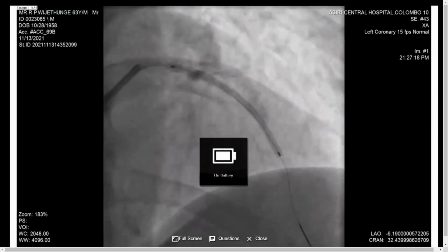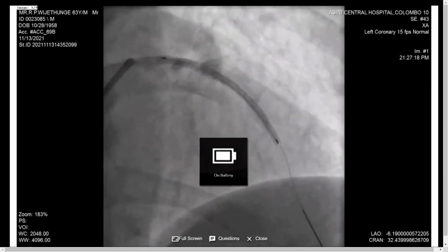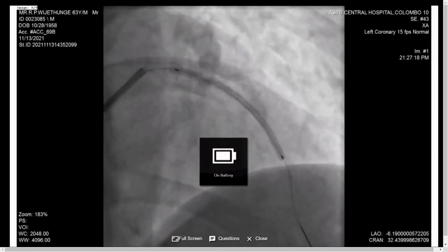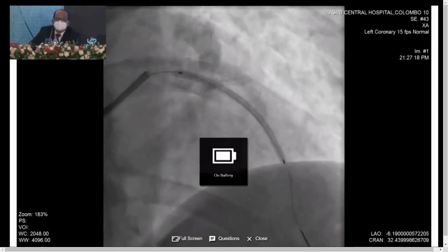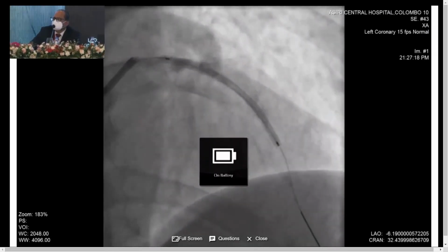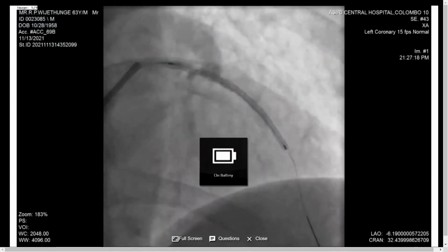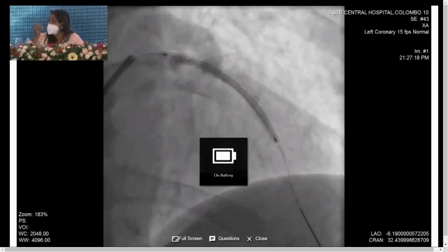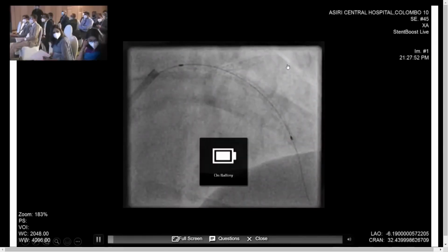Another important thing here is that when you are deploying the second stent, you are not keeping a wire across the branch, because with metal to metal contact the wire can be broken or cut. So you are not going to jail that wire at this point. That's why I always say on the main wire we are not going to change in DK crush. We keep the wire, and after the second stent deployment, now you need to rewire the branch.